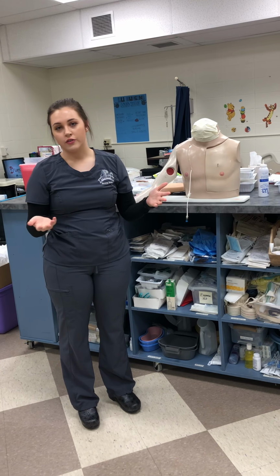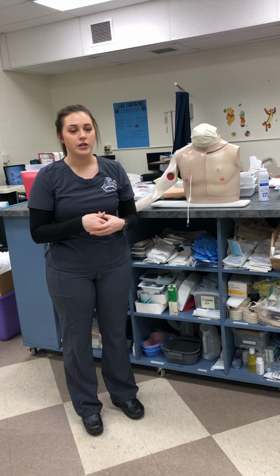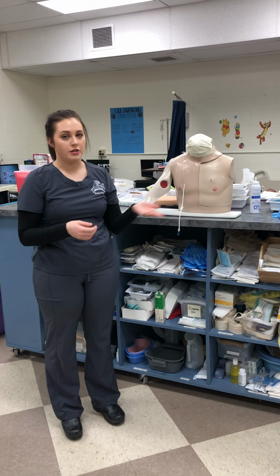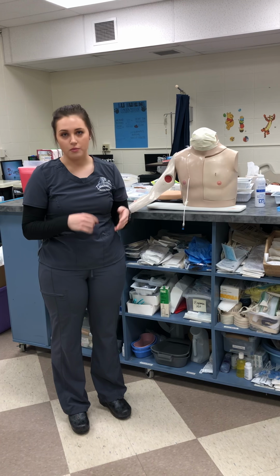When you access a port, typically there's several different kinds, but today I'm going to be doing a Metaport, and that's just right here in the chest. So my patient is in the hospital setting, and this is how we're going to administer medications, draw blood, that sort of thing.